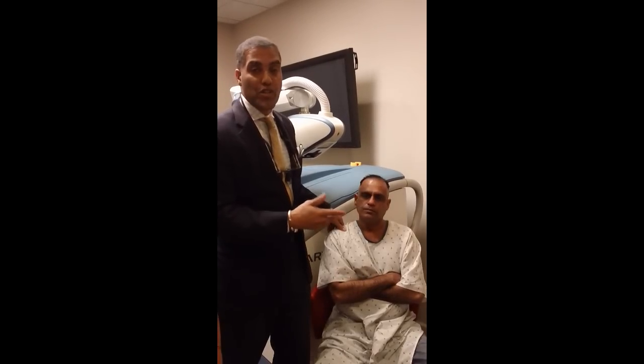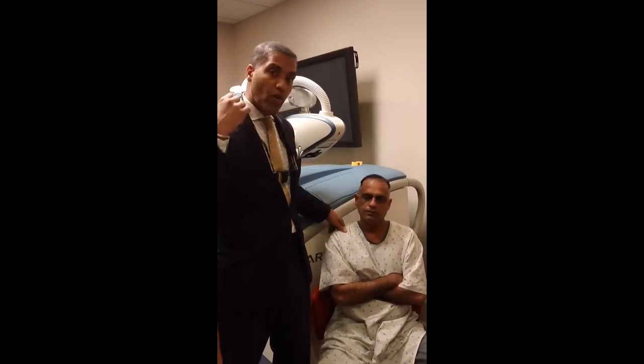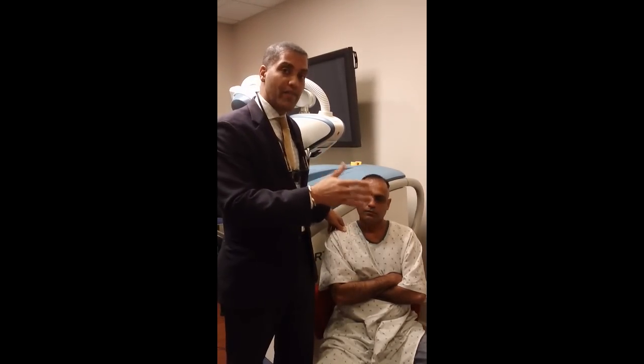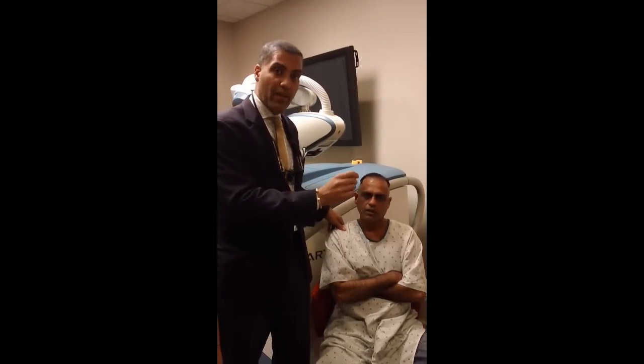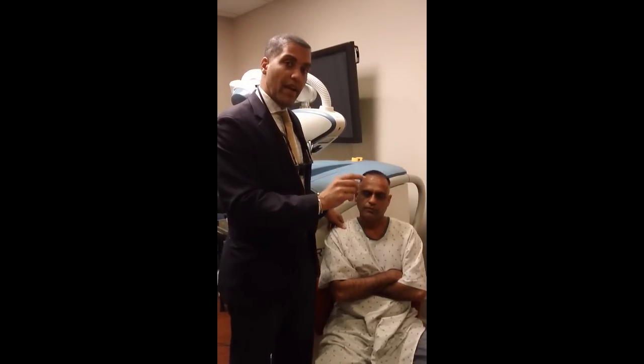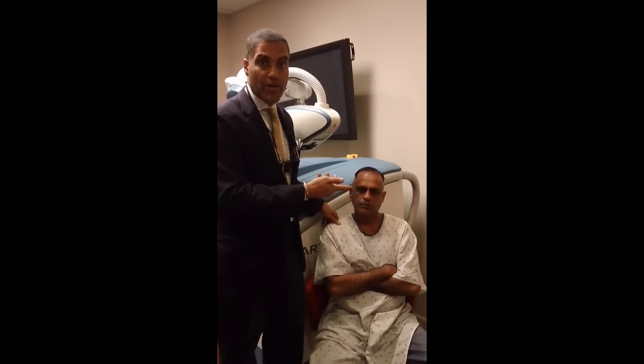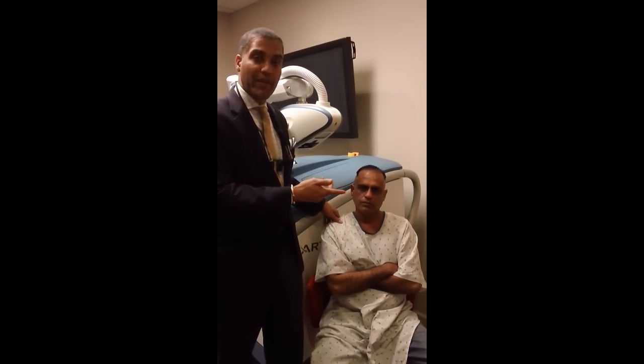Ali's a nurse and we showed him all the grafts. What really counts — it doesn't matter what system you use, whether you do it by hand or with the ARTAS — are that the grafts look good. Because if you plant bad grafts, it will not grow. These grafts were beautiful, just as good as the grafts that I get when I use the SAFE system. So I say, so far, thumbs up with the ARTAS system. The proof's in the pudding.